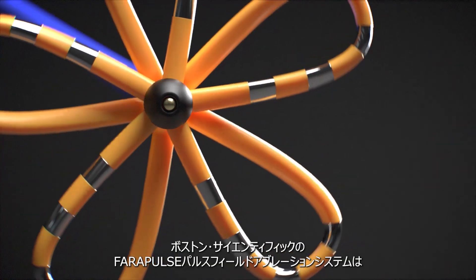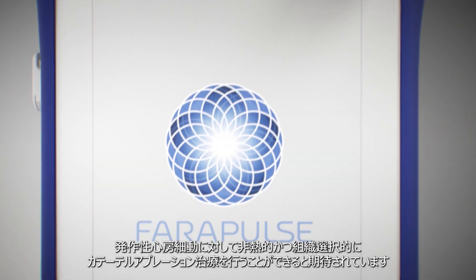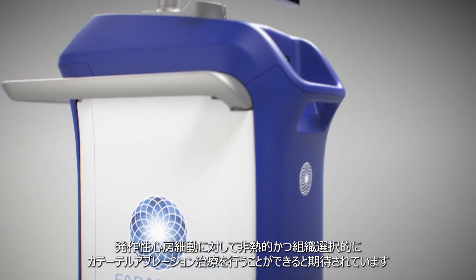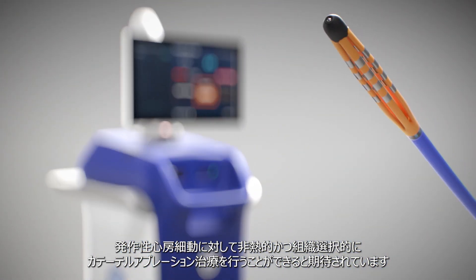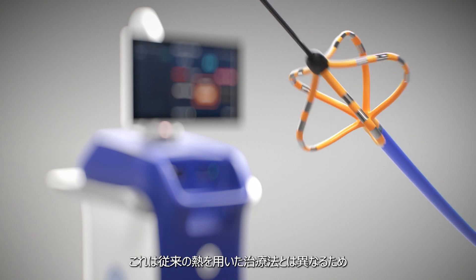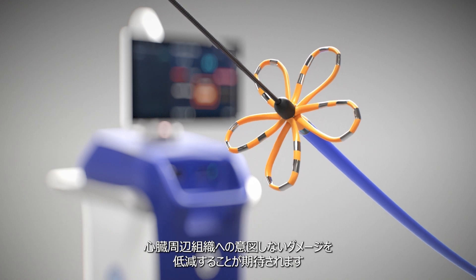The Farapulse Pulsed Field Ablation System by Boston Scientific offers a non-thermal and tissue-selective approach to cardiac ablation and treatment of paroxysmal atrial fibrillation, by addressing traditional thermal ablation limitations which can include inadvertently damaging collateral tissues.